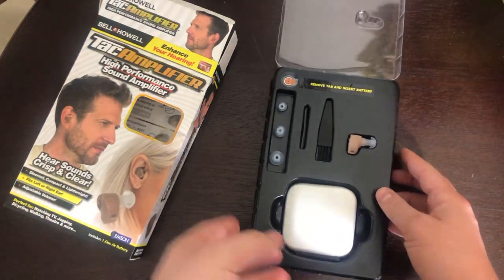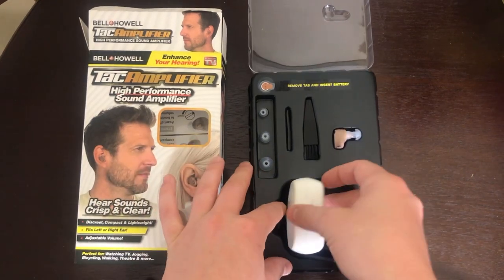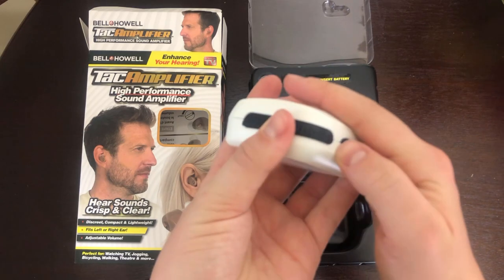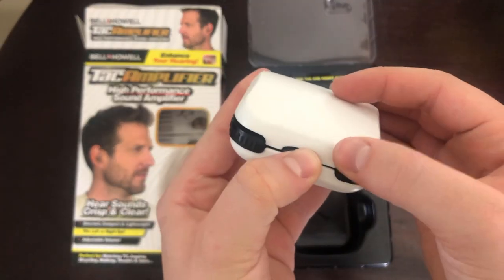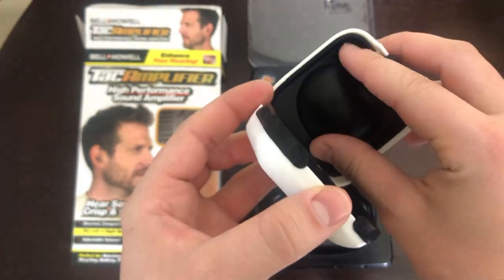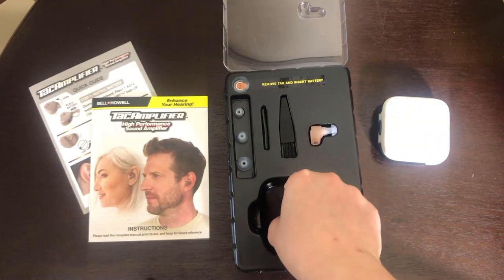Here's the product — you can see the cleaning tools, the actual component, and a variety of different earpieces. I thought this was a unique part of the product: it comes with its own little carrying case, which is pretty great because you can just throw it in your bag. It's white, so you can easily find it.